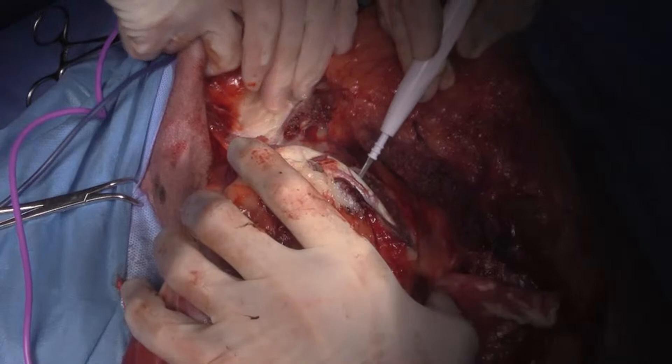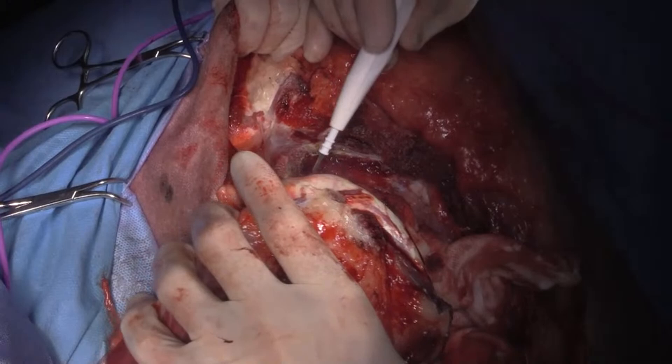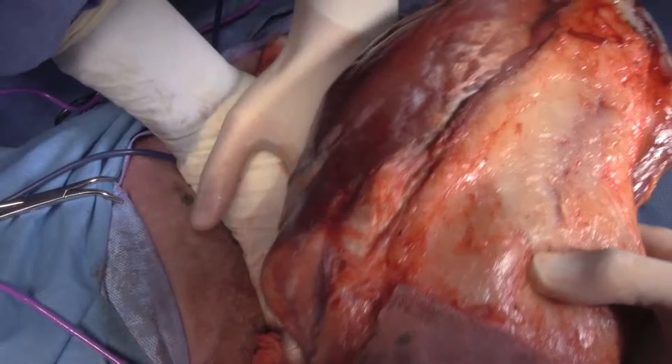The leg is off there. We'll just keep some pressure there. So that's the leg there. It's a big leg — can you zoom out for me?